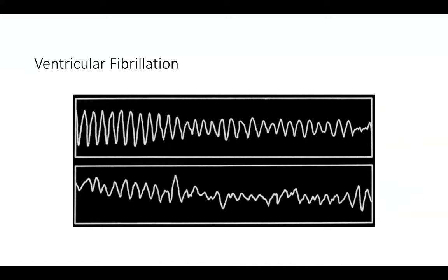Then, as you said, for those that are at risk, we heard of a case. Let me just share that case here. We heard of a case of a patient with HCM, very bad thickened left ventricle. The patient went for an ICD. The aim of that ICD is to protect that patient from lethal arrhythmias like ventricular fibrillation or ventricular tachycardia that may kill them very fast. That is the aim of the ICD. And most times, if there is no indication for pacing, you just go ahead and put in a single chamber ICD for them. Now, that ICD is not aimed to stop the HCM from progressing down the line. It doesn't do that. So despite the ICD, you will still put that group of people on their medication.